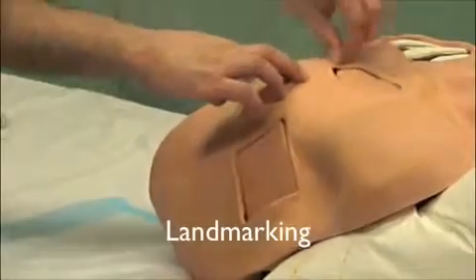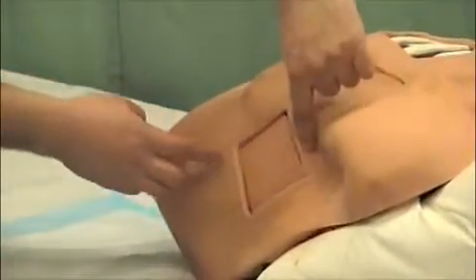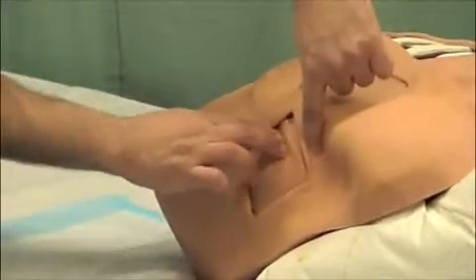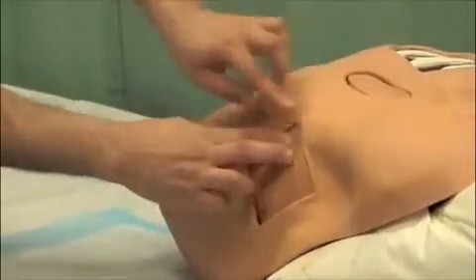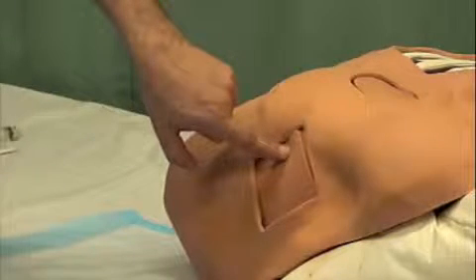The usual insertion site is at the 4th or 5th intercostal space between the mid and anterior axillary lines. Care should be taken to avoid insertion through breast tissue. If necessary, retract breast tissue with tape.